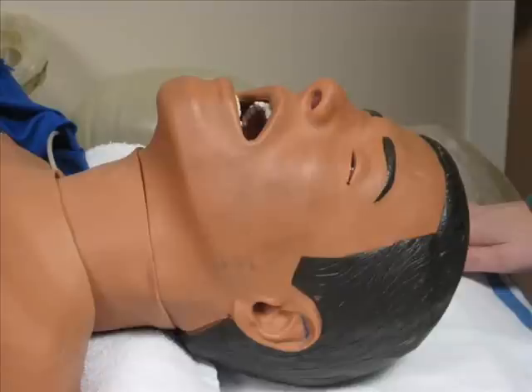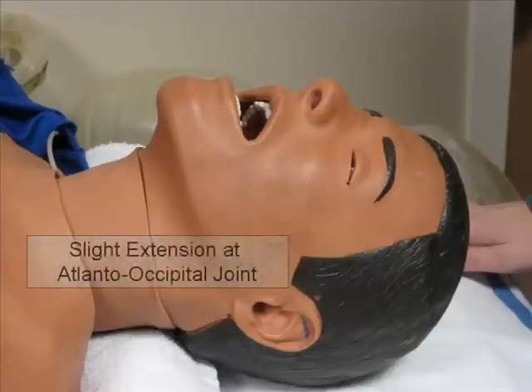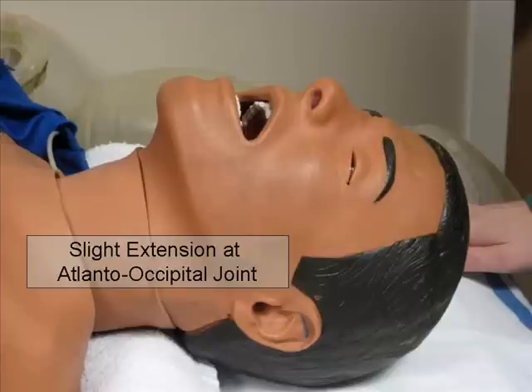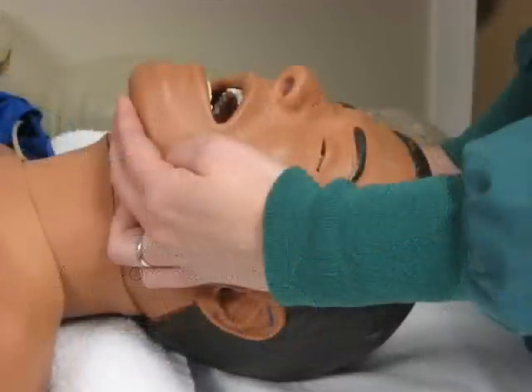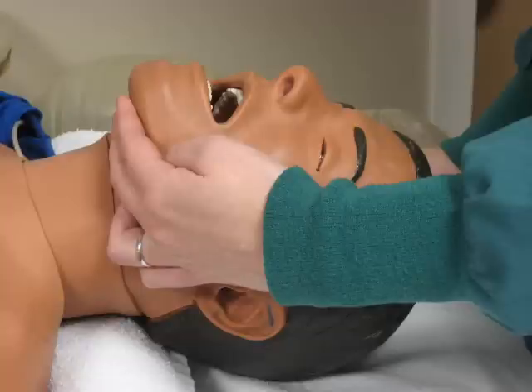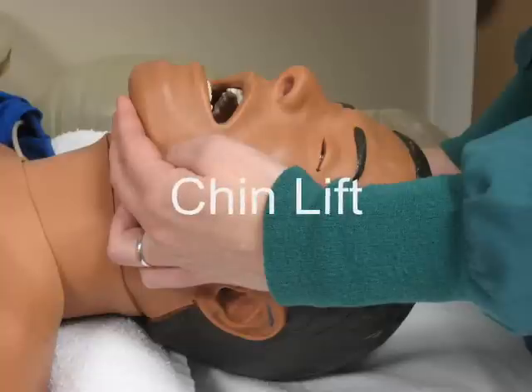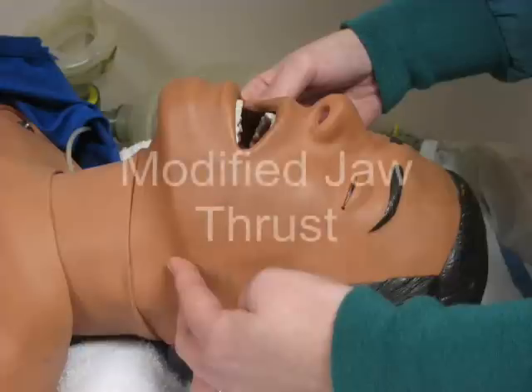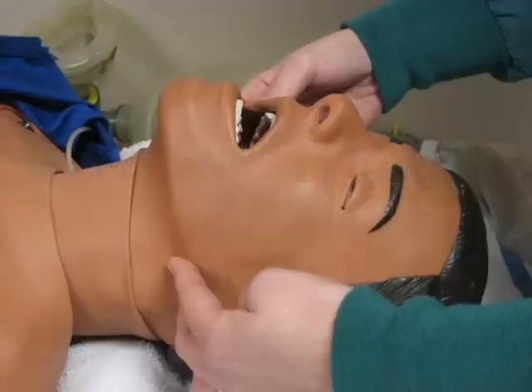Properly position the patient with the alignment of the airway. This includes slight extension at the atlanto-occipital joint. The evaluator may also assess the alignment procedures using a chin lift or modified jaw thrust procedure. You should be prepared for both.